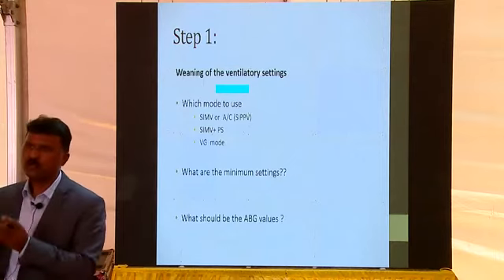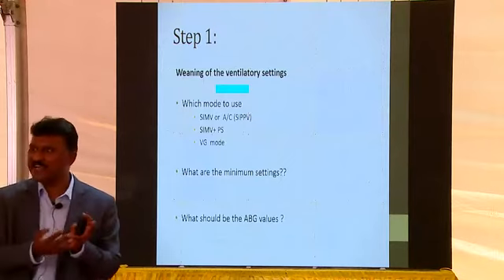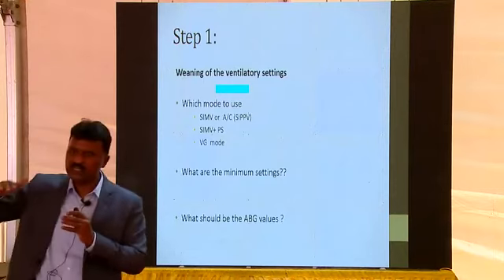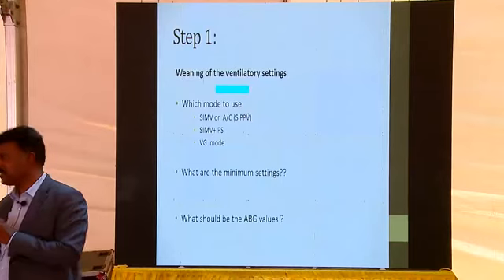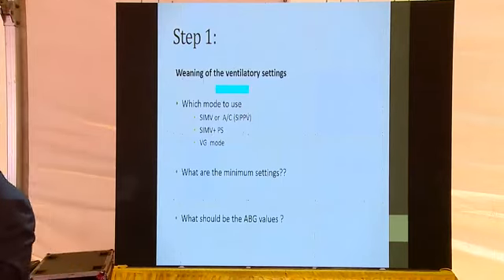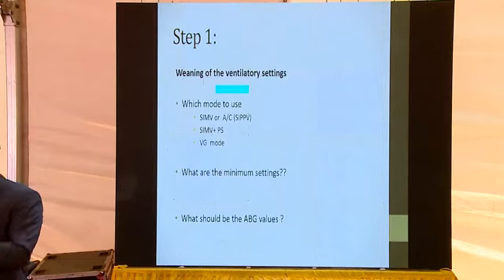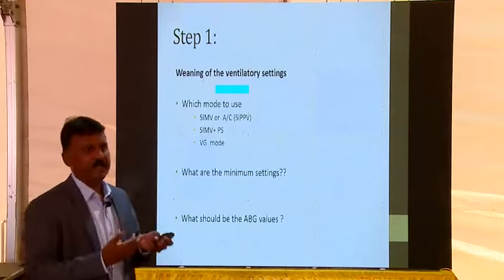So 14 by 4, with rates of, as I told you, 20, 25. The same thing happens with the tidal volume.